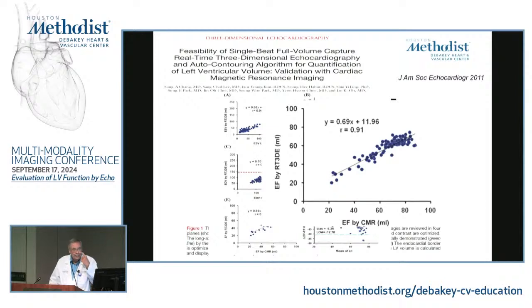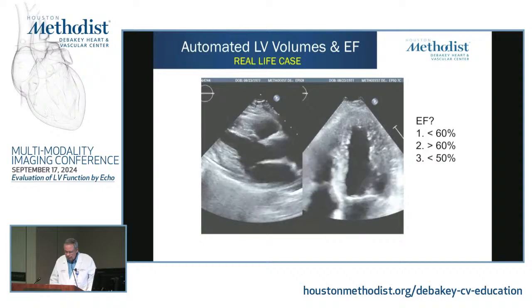Do I believe my eyes? Do I believe the 3D number? If you are a very experienced EF estimator, like many of us are here, then you would believe your eye and basically get rid of the 3D number if you don't believe it. But the problem is, when you take this to the big use by everybody, you can see where the problem could be. So let's do a real case, real time.